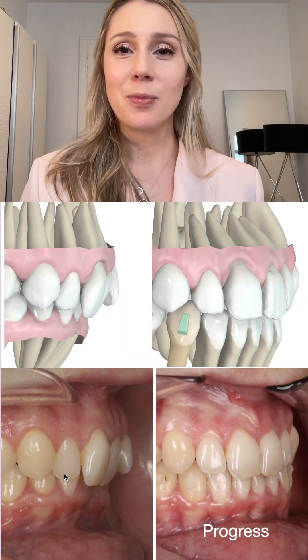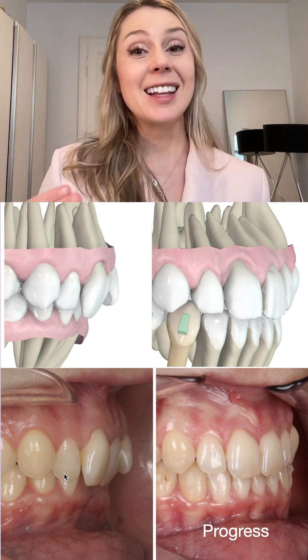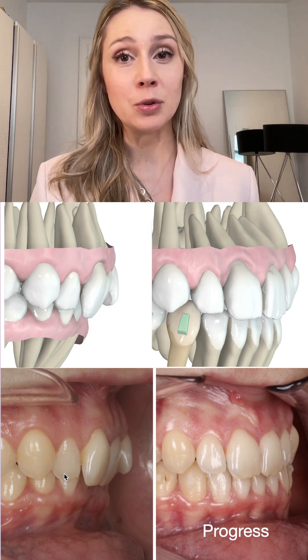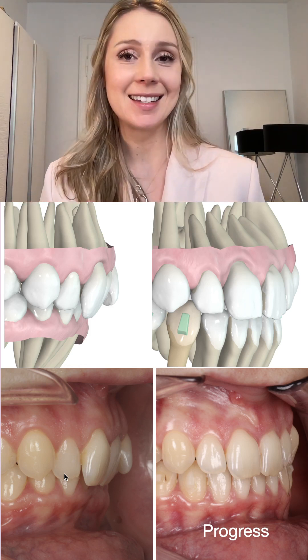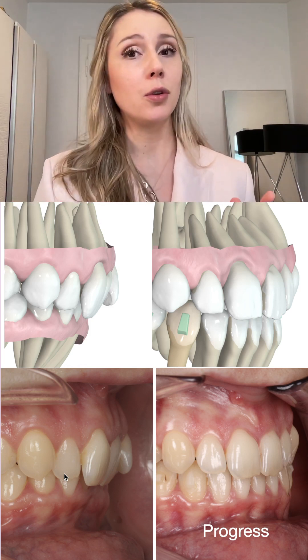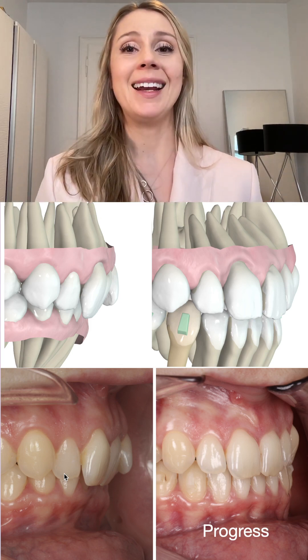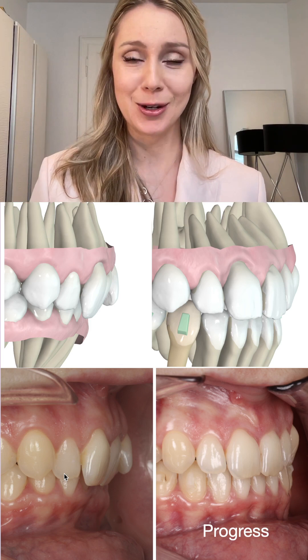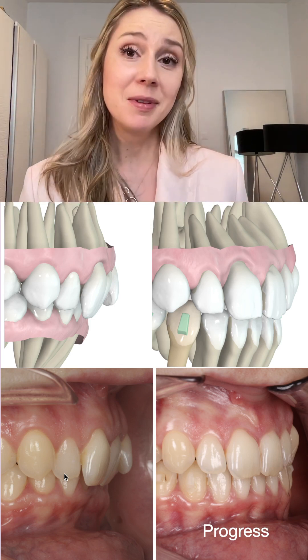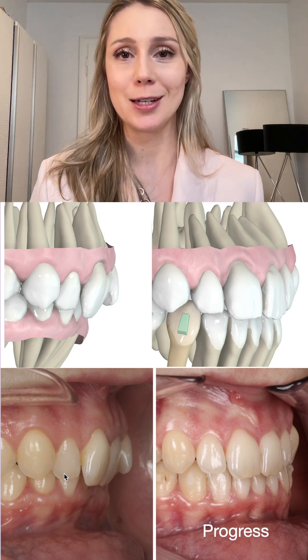This probably raises another question: Class II elastics are counterproductive for lingual root torque — they work against that movement. So in cases where I know I'll be using a lot of Class II elastics, I plan extra lingual root torque as an overcorrection, to compensate for what will be lost due to the use of Class II elastics.